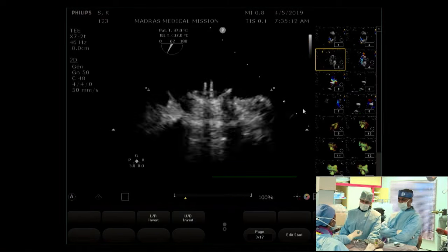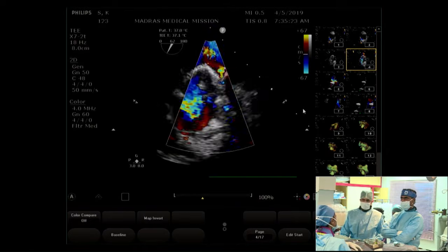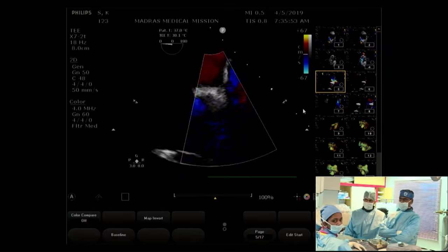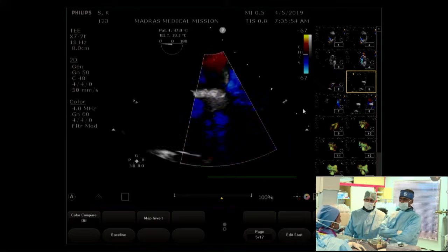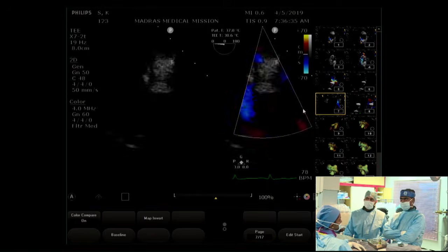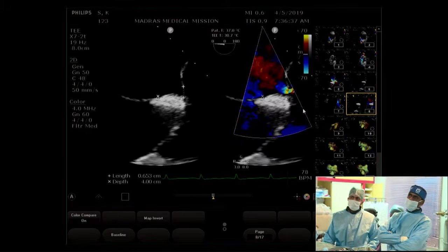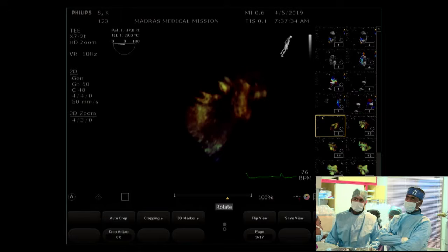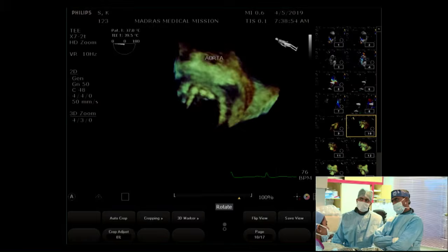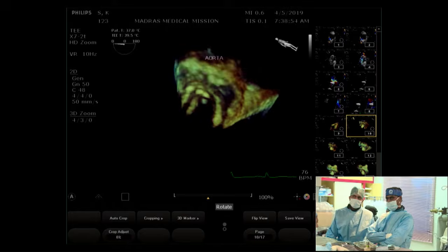So this is the mitral valve, a bileaflet valve, which has normal leaflet mobility and is functioning normally without any gradient. This is the medial paravalvular leak, which is seen very close to the interatrial septum. In this view, it's measuring around 7 millimeter. This is showing the same leak with color comparison. It's measuring around 7 millimeter again, and this is a 3D localized zoomed view, which shows the leak in the anteromedial part of the mitral annulus, and the aorta is seen above.